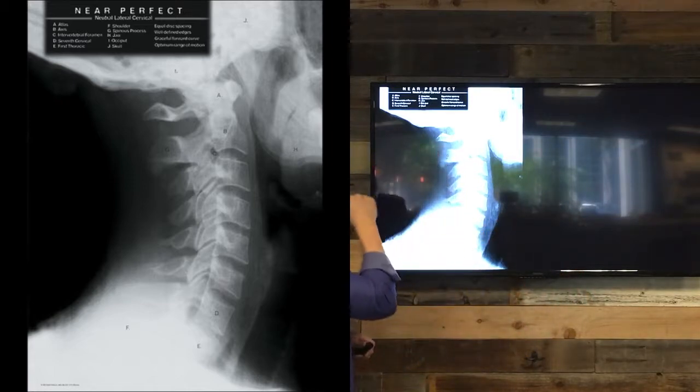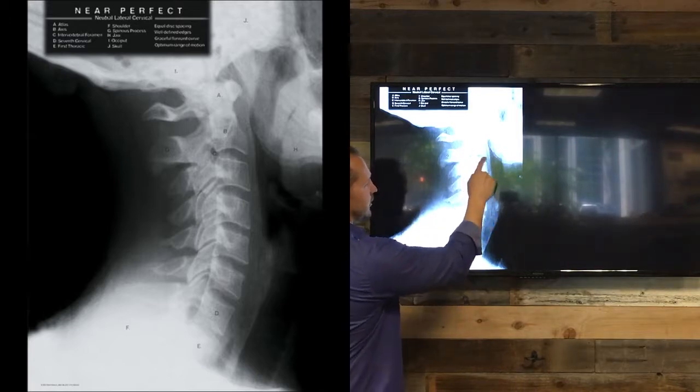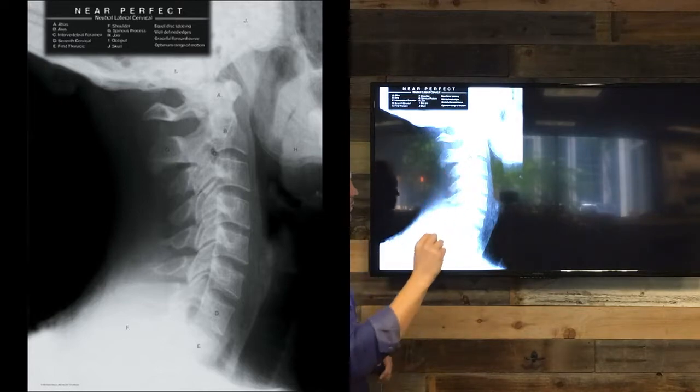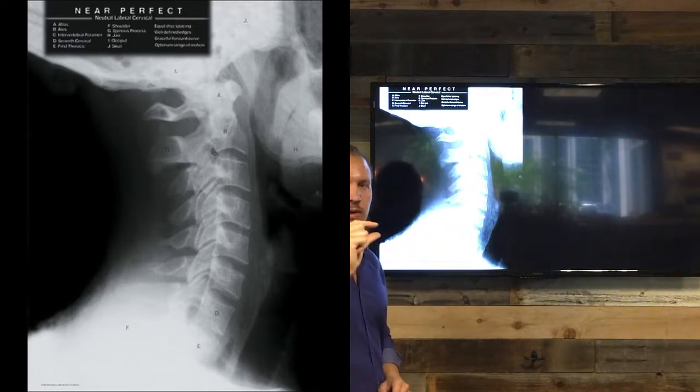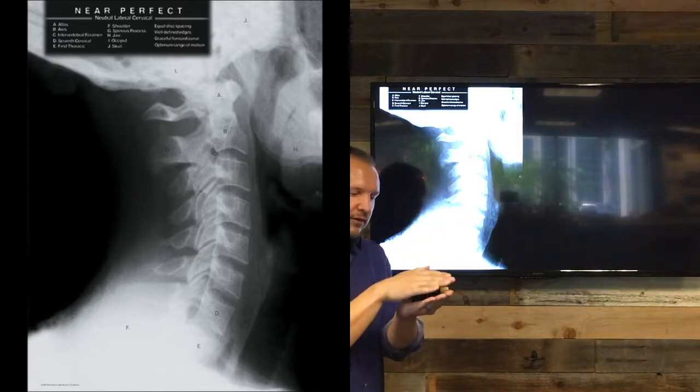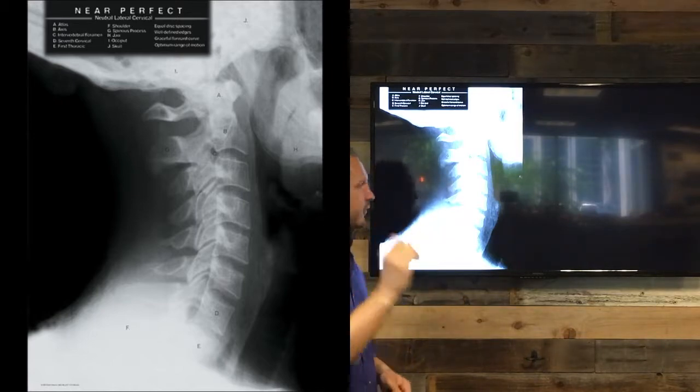So a couple other things I want you to notice. If you see the spacing between the bones, that's the disc spacing. We want to see clear, equal, thick disc spacing. That's really important because the nerves come out right in between the discs. So if you don't have enough disc spacing, you're also getting nerve compression.